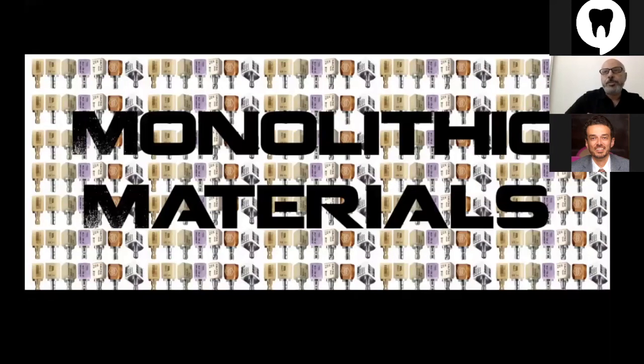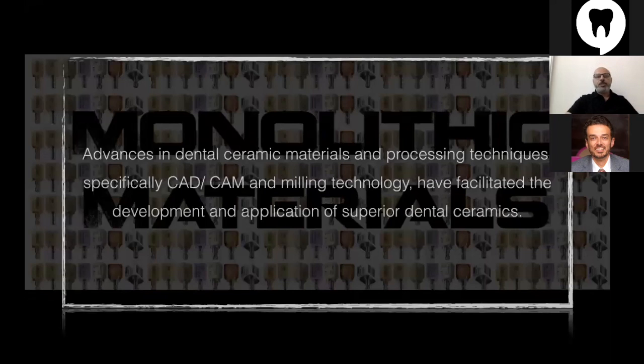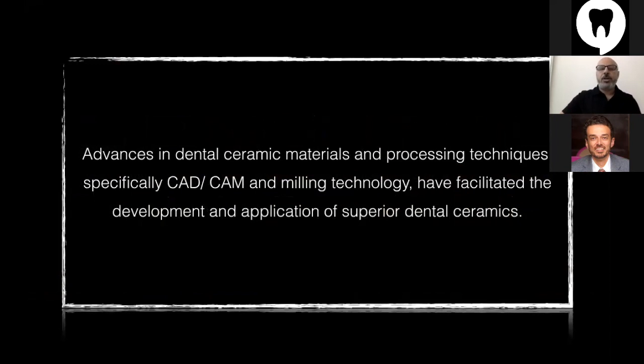You can do beautiful anterior restorations with these monolithic materials, ranging from the low-strength feldspathic to high-strength zirconia ceramics. Nowadays, the advances in dental ceramics and processing techniques have facilitated the development and application of superior dental ceramics, because all the companies are fabricating materials specifically for CAD-CAM.